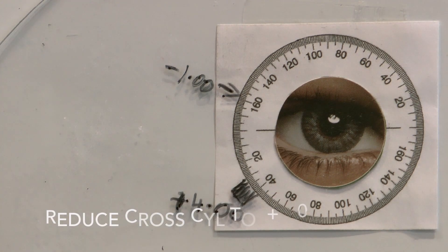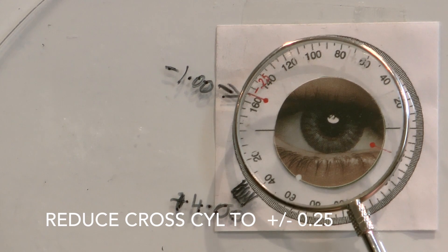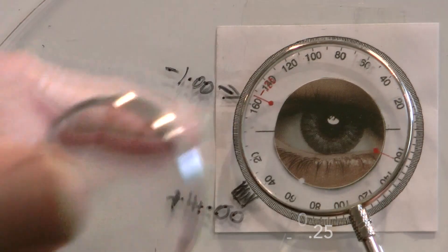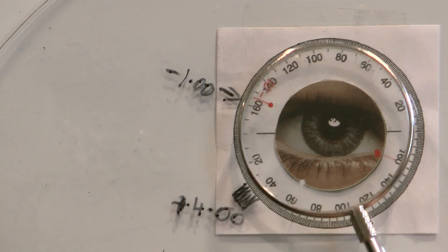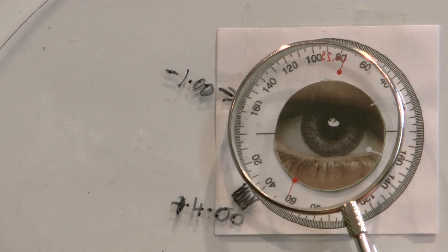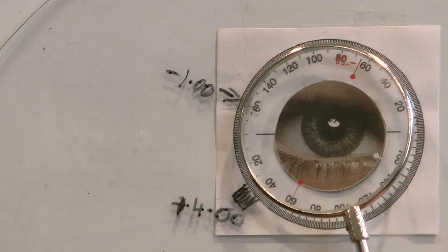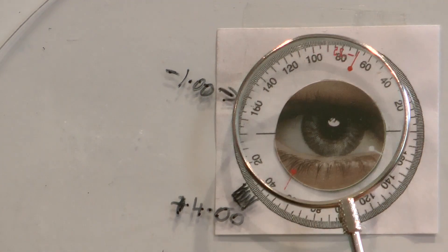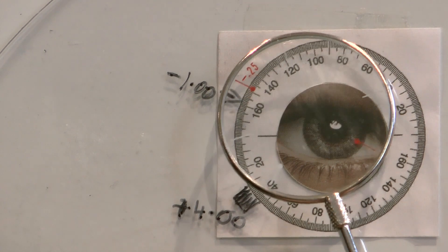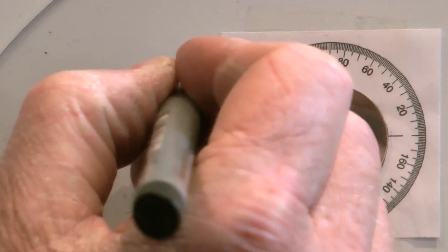We're going to see if the patient wants any more minus in that meridian. At this point you reduce to a 0.25 cross cylinder and ask the same question: do those circles look more round, darker and sharper in position one or in position two? You're increasing the cylinder in position one. If they say they like position one better, we can then increase the cylinder power by 0.25, changing it to minus 1.25.